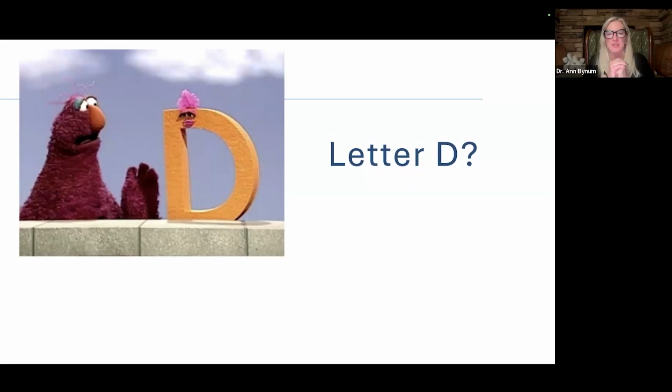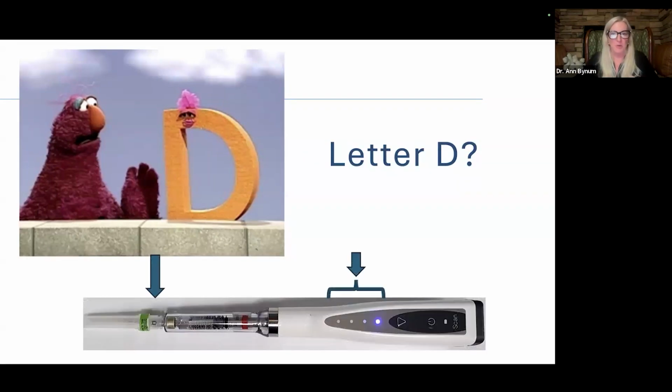But if you want your patient to be the most comfortable, you want to be able to lay that tip of the needle. You are not pushing or puncturing that needle in. You're literally laying it against the tissue and letting it almost melt into the tissue right there. So the letter D is very important.